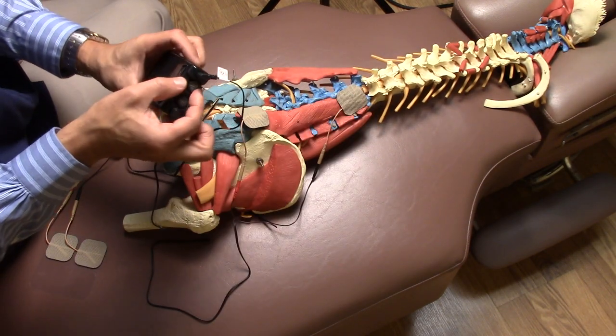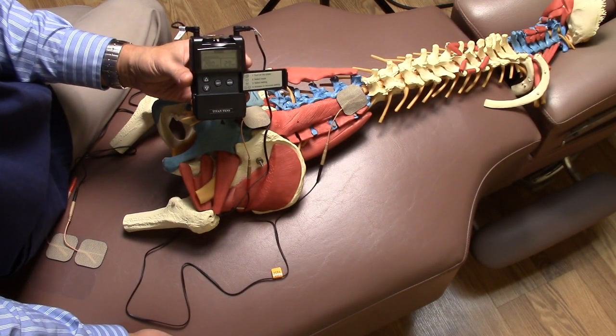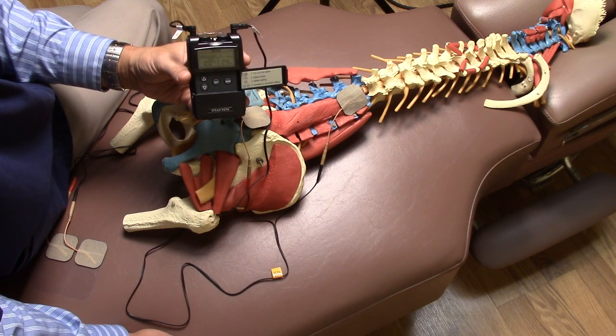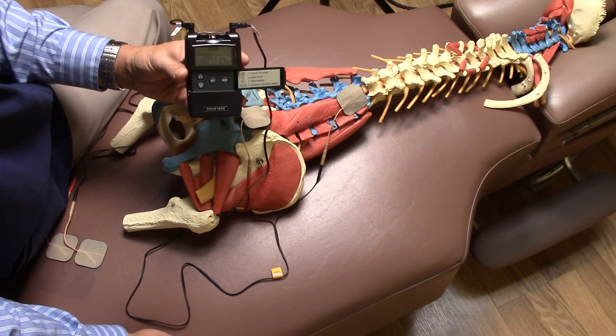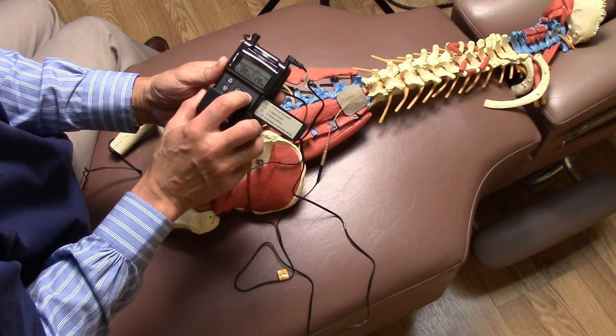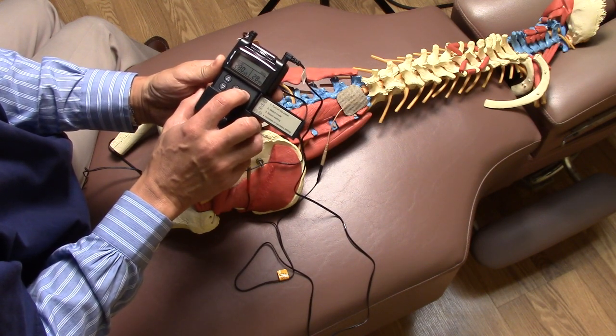Go ahead and turn it on. Most TENS units, this one included, come with pre-installed modes of operation. This one has burst mode, normal, modulation, SD1, and SD2.